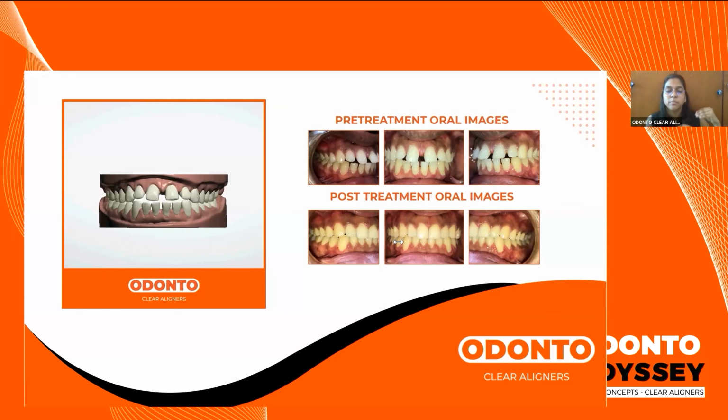What we do is we perform the proximal reduction only when we have good contacts. So if there is a case wherein the teeth are at an angle or so, then this is not where we can perform it, because then you're just slicing off one tooth. You're not really breaking the contact and trying to gain space.